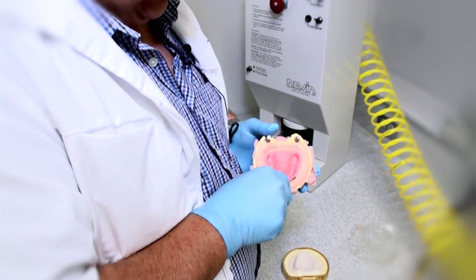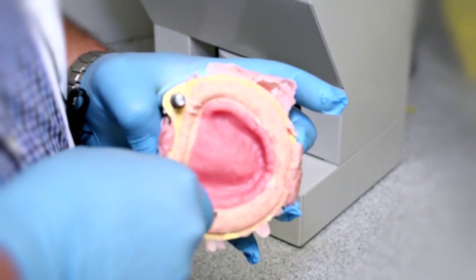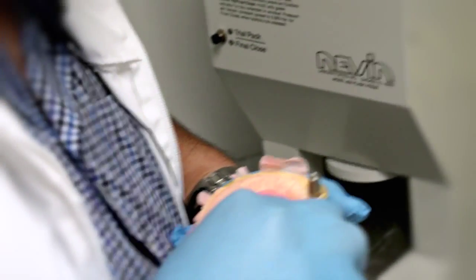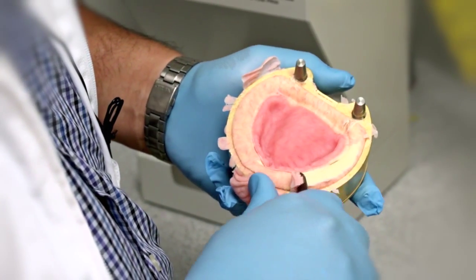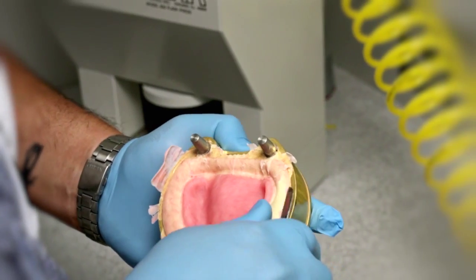We take our knife and cut the flash off, because the flash will cause an open bite, and we've gone to great pains and great lengths to set our case and articulate everything properly, and then to end up with an open bite because we didn't trial pack would, in my book, be a sin.